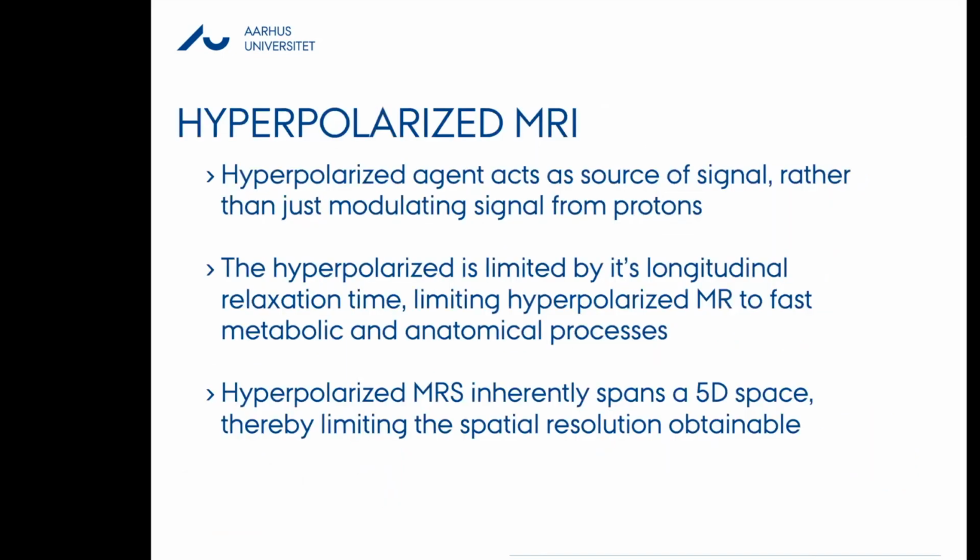And again, it's important to mention that hyperpolarization signals or contrasts are very different from the conventional way of creating contrast in an MRI machine, where we rely on the water signals and how they are making contrast by changing the surrounding tissues or relaxation properties. We are actually getting the signals directly from, or the contrast directly from, the molecules that we've injected.